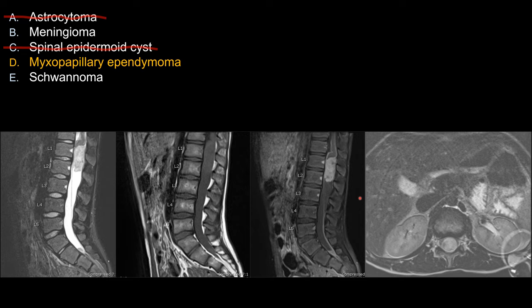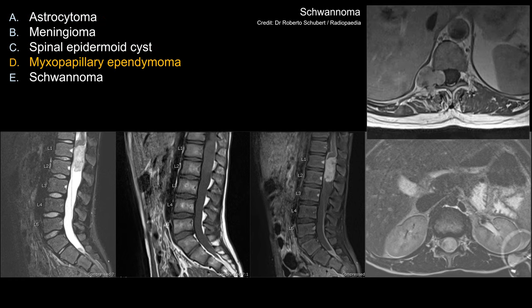For choices B and E — meningioma and schwannoma — they are two of the most common intradural extramedullary lesions in the spine, so by statistics they are a good choice. But for the purpose of a board exam, as far as classic appearance is concerned, for meningioma I will show you one that should demonstrate a dural tail. And for schwannoma, the classic appearance is a dumbbell-shaped lesion with an intracanal and extracanal component with expansion of the neuroforamina — as demonstrated by Radiopaedia.